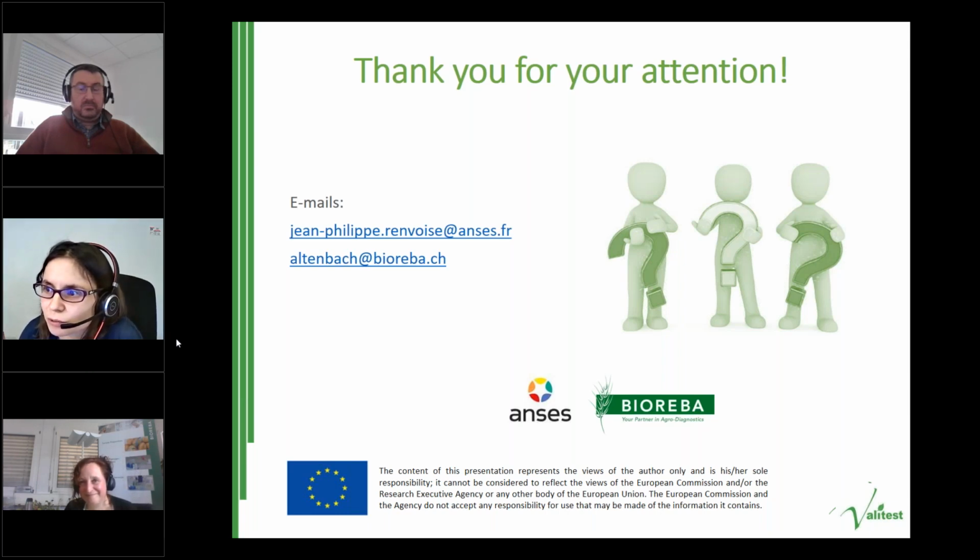So there was a question from Simona, how to choose the real LC sample? Is the material sufficient? She is asking if it's sufficient if the material is just asymptomatic. Maybe Jean-Philippe, you can answer this question. Well, if the on-site test you try to evaluate says clearly that the plant material should be symptomatic, you shouldn't do that.